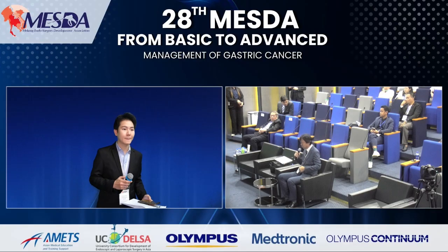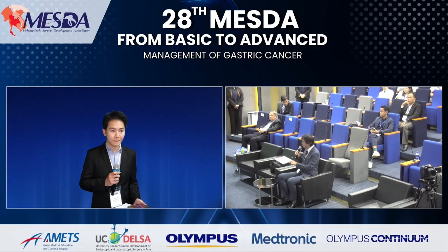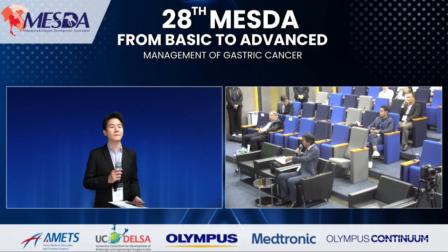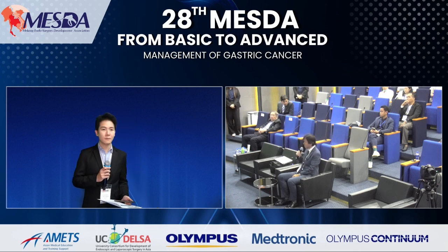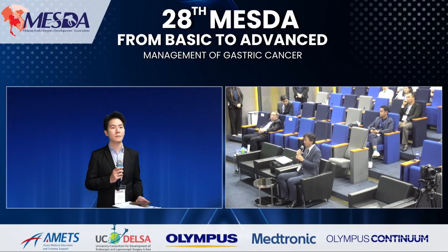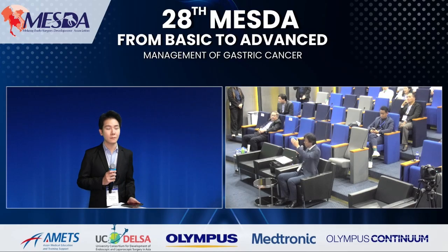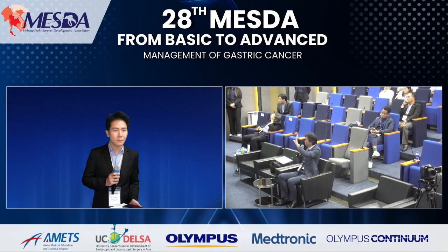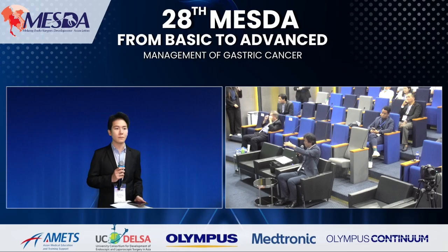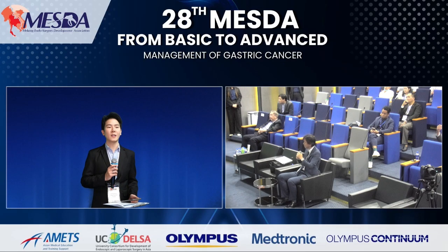Thank you very much for that question. Of course, in distal gastrectomy, we start with the greater curvature side, then the lesser curvature side and the suprapancreatic areas. This is the standard procedure. But if the tumor is located in the very upper side or is more advanced gastric cancer, I prefer to start with the suprapancreatic side first, then the greater curvature and lesser curvature side. So, superior approach. I prefer the superior approach.